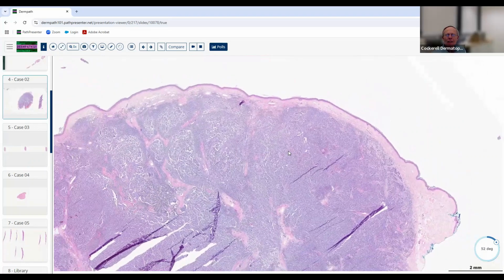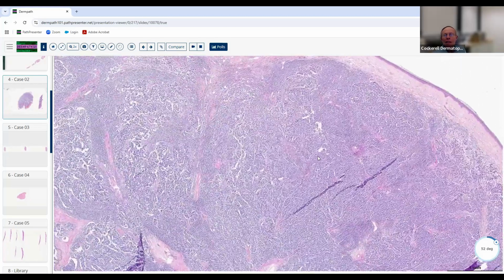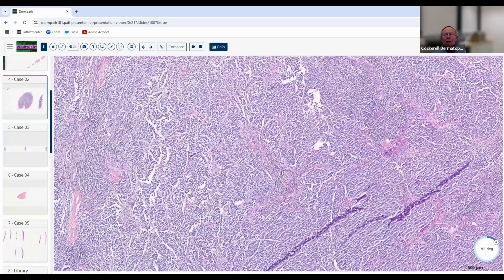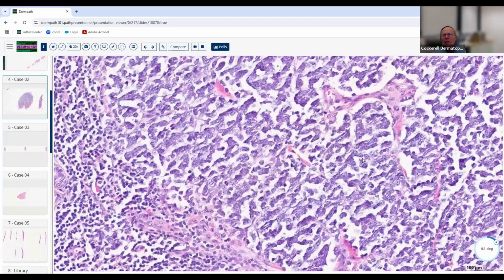It doesn't look like the cells are jet black. So again, I'm thinking it's probably not going to be a lymphoma, even though there are variants of lymphomas, large cell anaplastic lymphomas, for example, those large B-cell lymphomas, poorly differentiated B-cell lymphomas of the leg. Those cells can be so large that they don't look black anymore. They can look more purplish. So again, theoretically it could still be that. But as you get to higher magnification, it really doesn't look very much like it. These are not really lymphocytes.